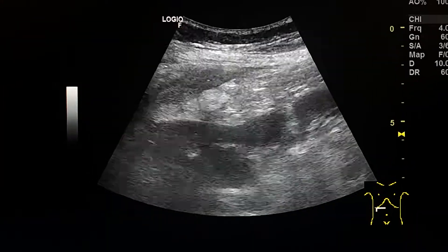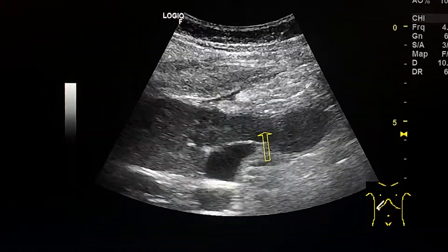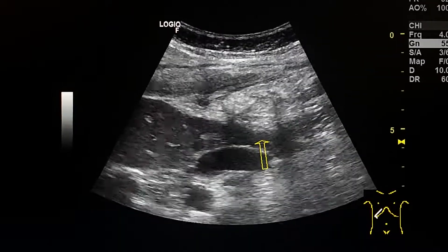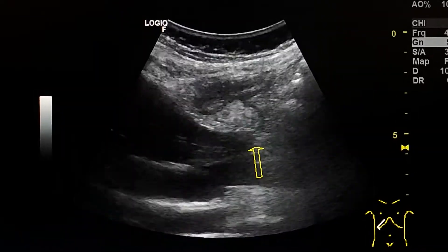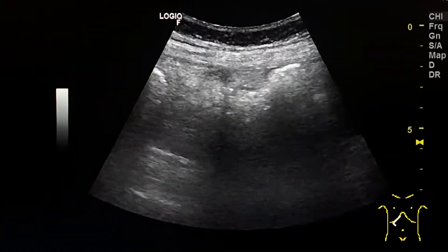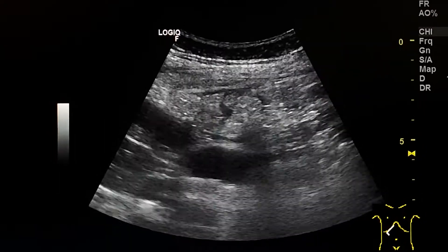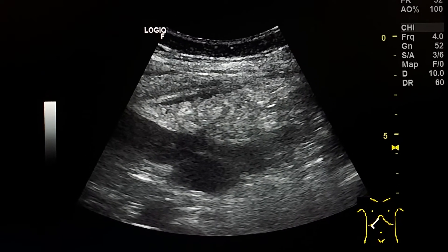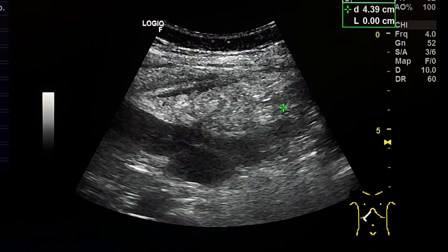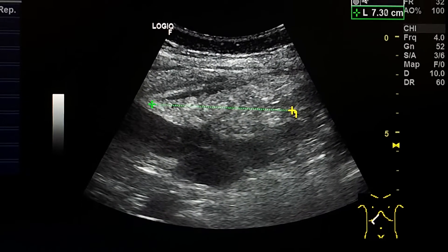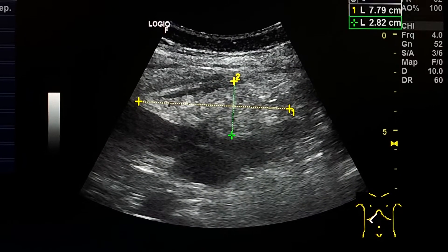We see only echogenic fat. This is the area of omental infarction, fusiform in shape.